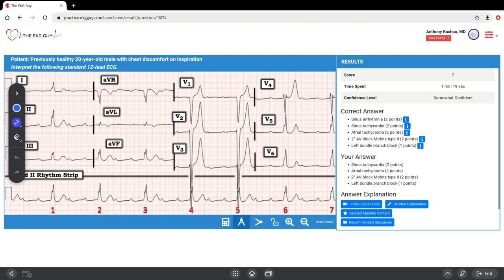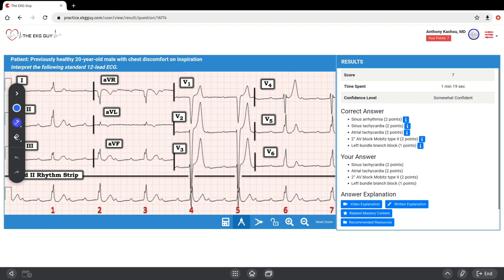What we're saying is there's likely two here that we can see between each R to R interval, and there might be one hidden in the QRS complex as well. You can see that the shape of these are different, and there might actually be atrial activity hidden within the QRS complex.